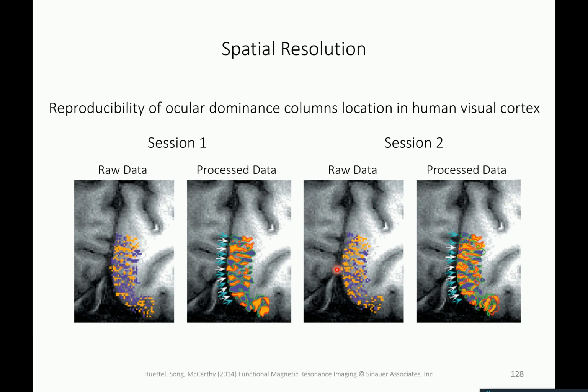So this shows that if you invest in optimizing the MR imaging process, and if you use a biological phenomenon that actually exists, so you need these ocular dominance columns to do something like this, and you also need to be lucky enough that the vascularization is so high and so specific that this is reflected, then one can push it to this level. That doesn't mean that you should expect to see this everywhere in every cognitive neuroimaging study, because not everywhere in the brain do you have ocular dominance columns or any neural structure that allows this. Also, you might have an entirely different sequence and so on. But one can push it to this.